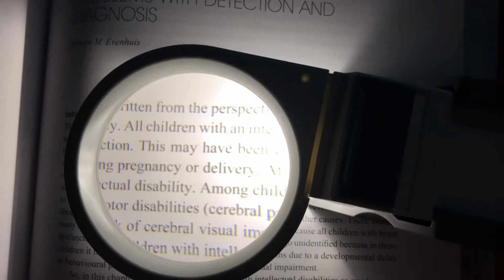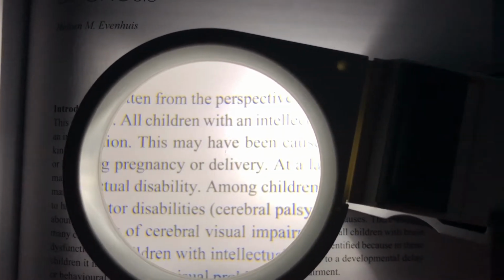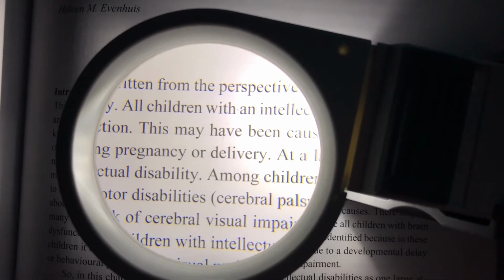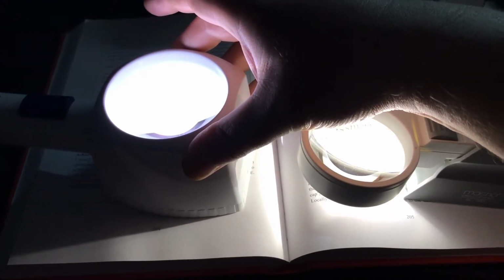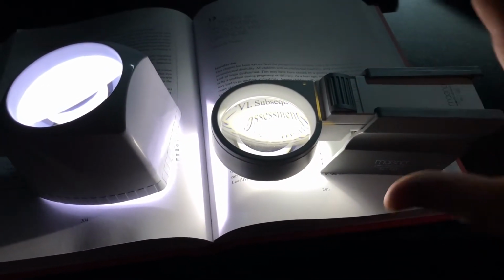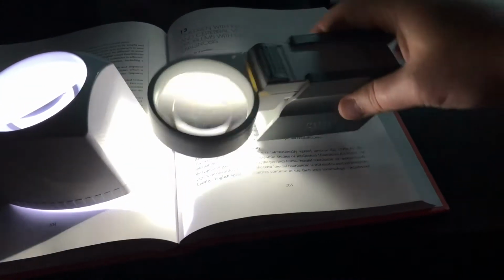The 4x stand magnifier likewise has similar features to the 3.5x. A little bit brighter up towards where the handle is, where the light source is coming from, but the viewing area still is very clear, and there's plenty of light. So for brightness through the lens, the Optelec has the brighter light in the viewing area as compared to the Magno. From a stand comparison though, the base of the Magno is much easier to put on a smaller area and keep steady versus the longer handled Powermag, which requires the kickstand in the back to stay stable.